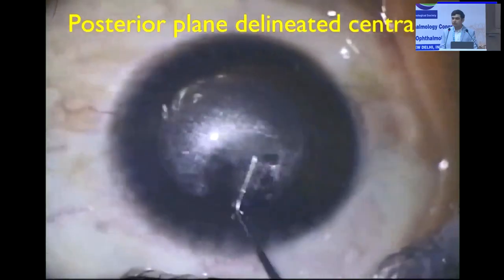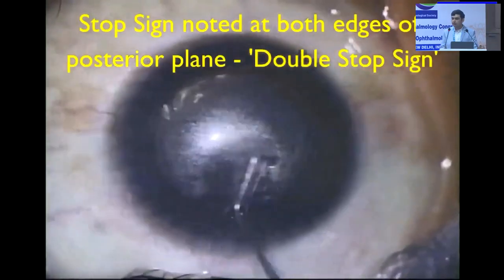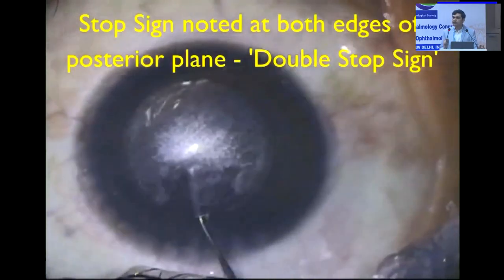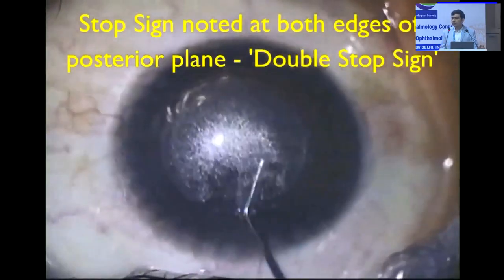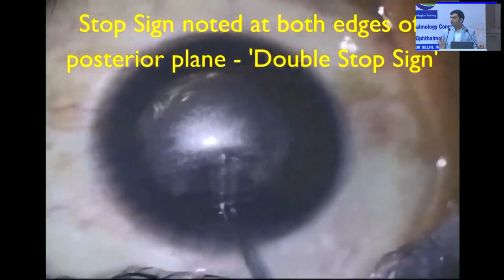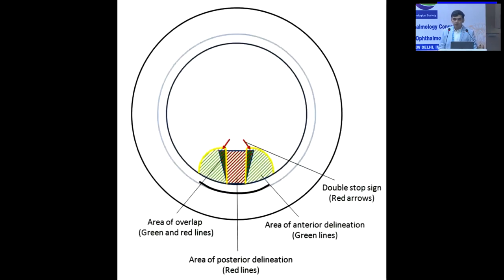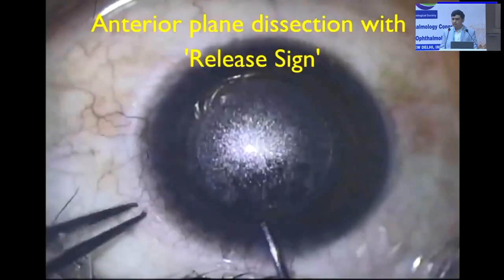Now when we do the posterior plane delineation, if you have done anterior delineation correctly on both sides, you will find what is the double stop sign or resistance on both the edges. If you don't find resistance on one of the edges, that means that anterior delineation might be in the posterior part itself. After you have noticed the double stop sign, the double stop sign ensures basically that the overlapping areas between the anterior and the posterior plane that you have delineated are correct in all the 3 segments that you have done before. So this helps you in getting a second checkpoint in terms of that you are in the correct plane.